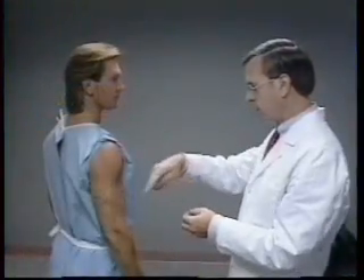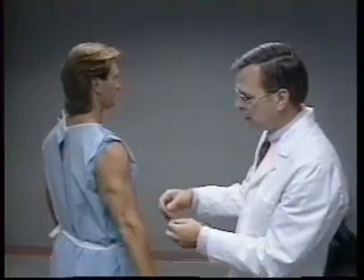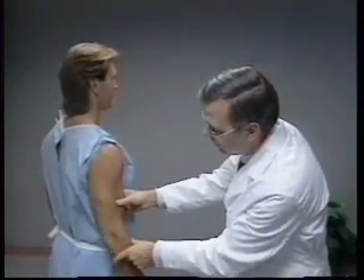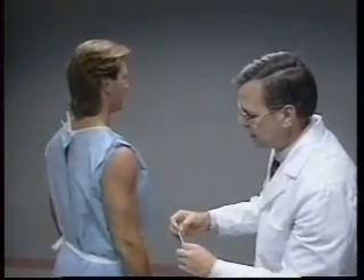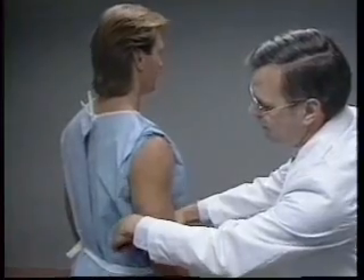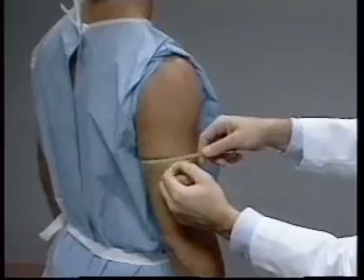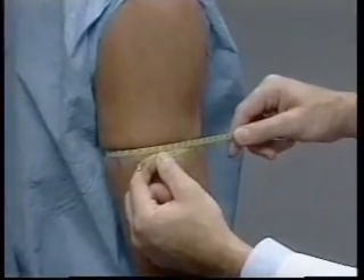Arm circumference is measured with the subject standing and with the right arm hanging loosely and relaxed. It's important to be certain that the muscle of the arm is not flexed or tightened, which could yield a larger and inaccurate reading. The technician stands to the right side of the subject and places a steel measuring tape around the upper arm perpendicular to the long axis of the arm at the marked point.